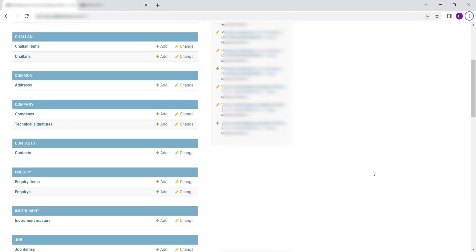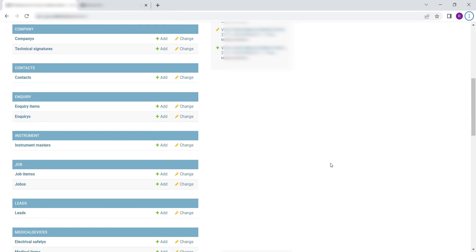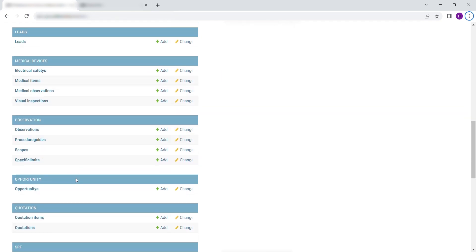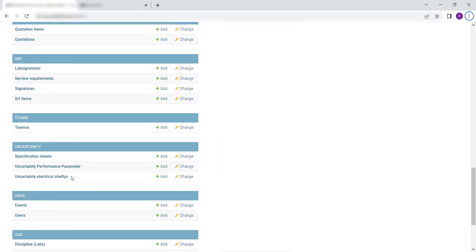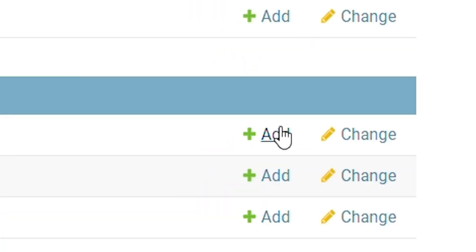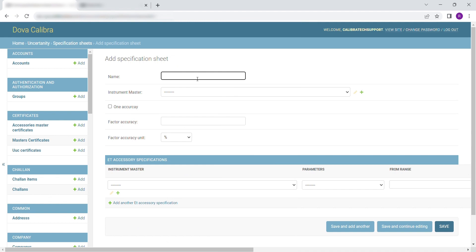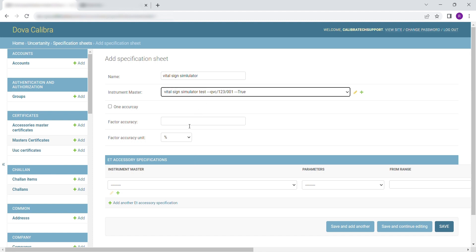To enter Master Specification Sheet, scroll down to Uncertainty. Select Specification Sheets. Then click on Add. Fill in the following details: enter the name for the sheet, then select the Instrument Master the sheet belongs to.